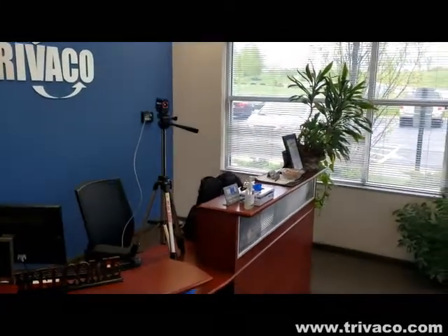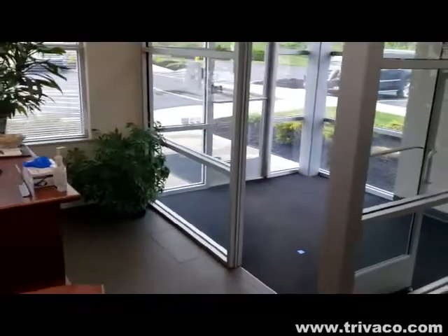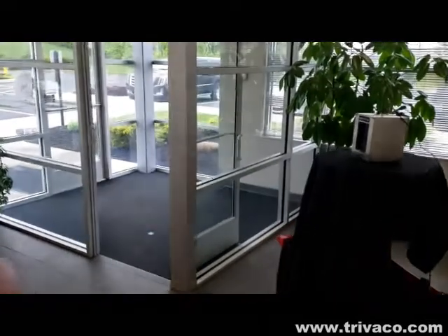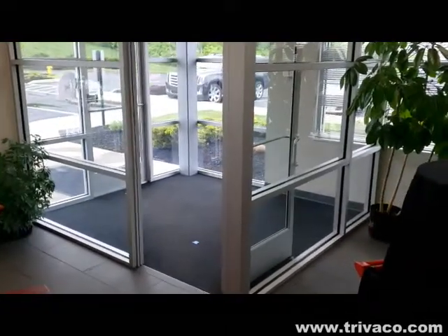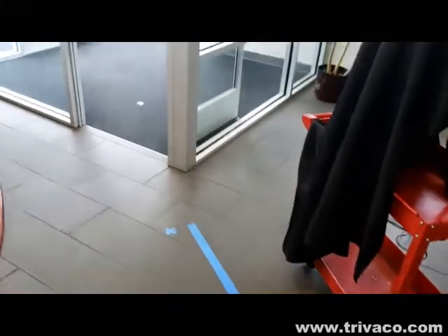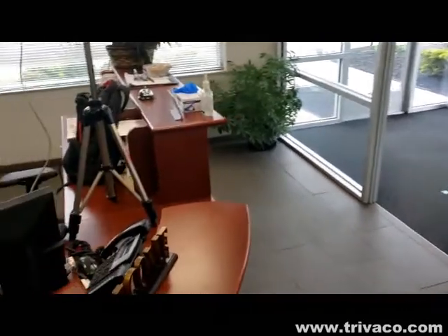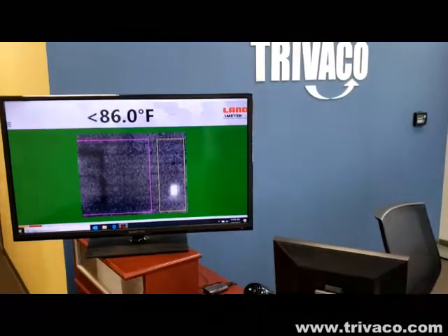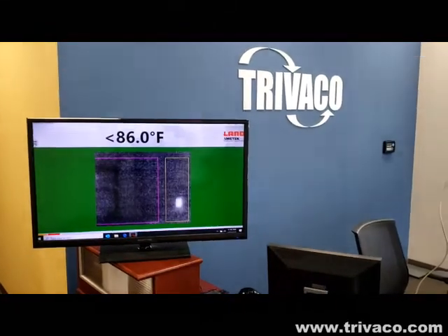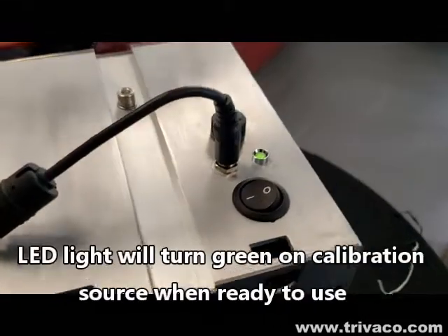We've mounted the imager on a tripod approximately three to six feet apart. Subjects will be coming in through the vestibule and will stand on a marked area. You can also notice our markings for social distancing. We've connected the system to a widescreen monitor for easy viewing and demonstration purposes.